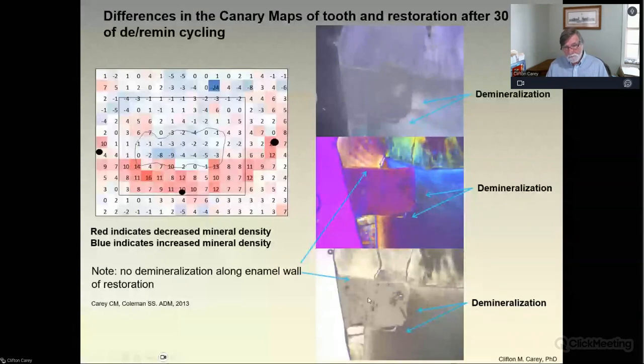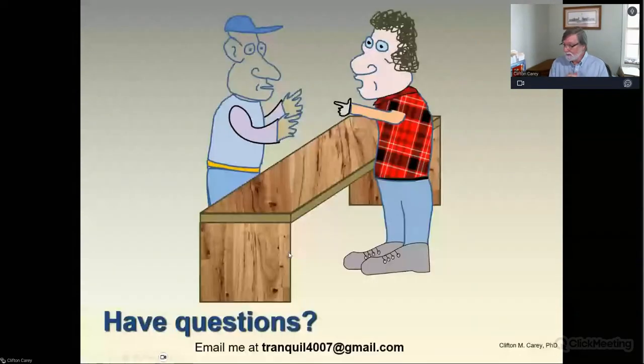And then down here, this is where the light is being shown through the system. Again, we see the demineralization area. We clearly see what the restoration looked like, complete with a pocket of unfilled resin. And some demineralization on the outside. Yes, this was not there when we started. And so you can see up here that same demineralization, and it's still up here and here. And so we did have demineralization at the surfaces and beginning to establish another lesion outside of the restoration. But the bigger piece of information was that we got much more demineralization deep within the lesion, below the restoration. So I'm going to stop right there.